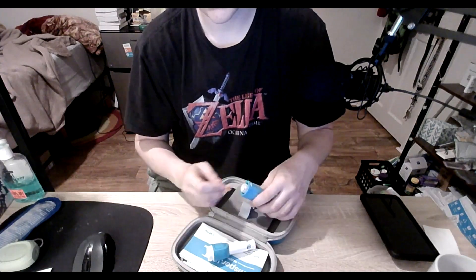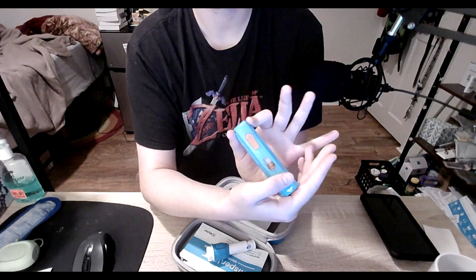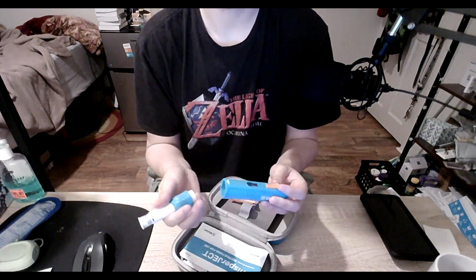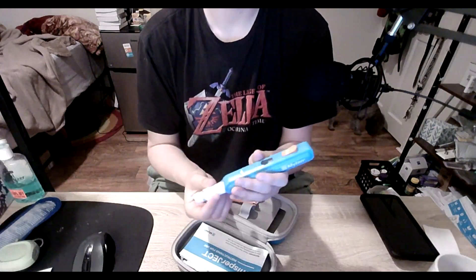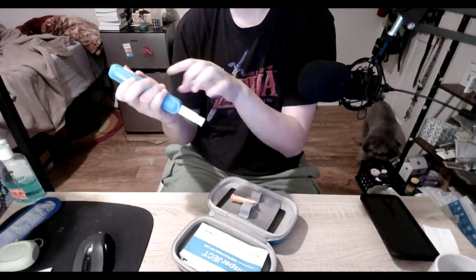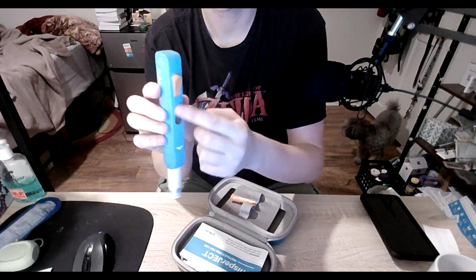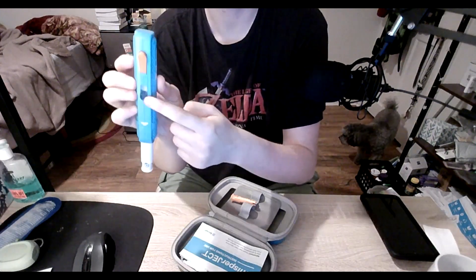So for this, you set this in there. You put the medication in here. You align this up until you hear a click. Then make sure that this doesn't have the green arrow in anymore, and you should be able to see part of the syringe in here.